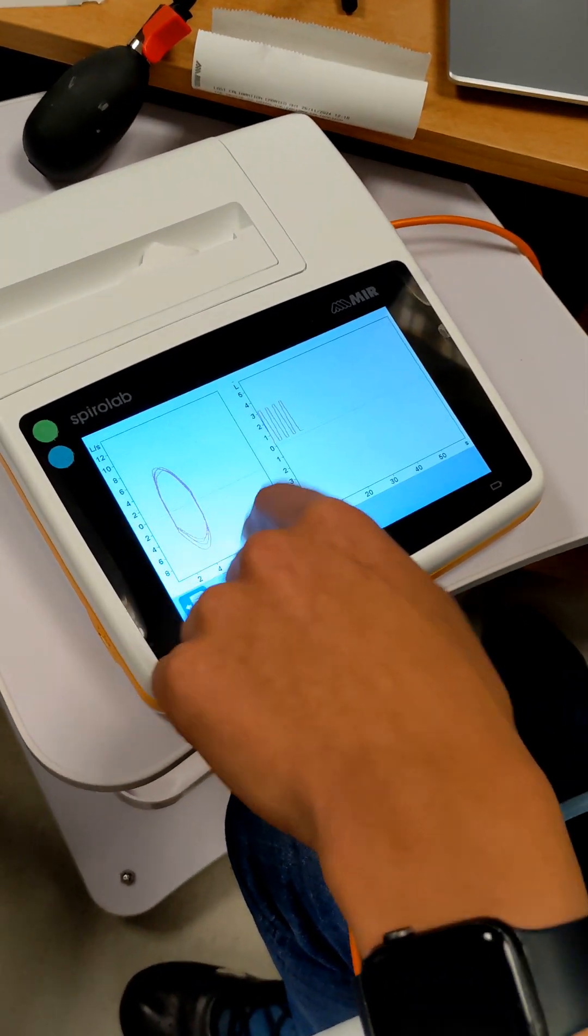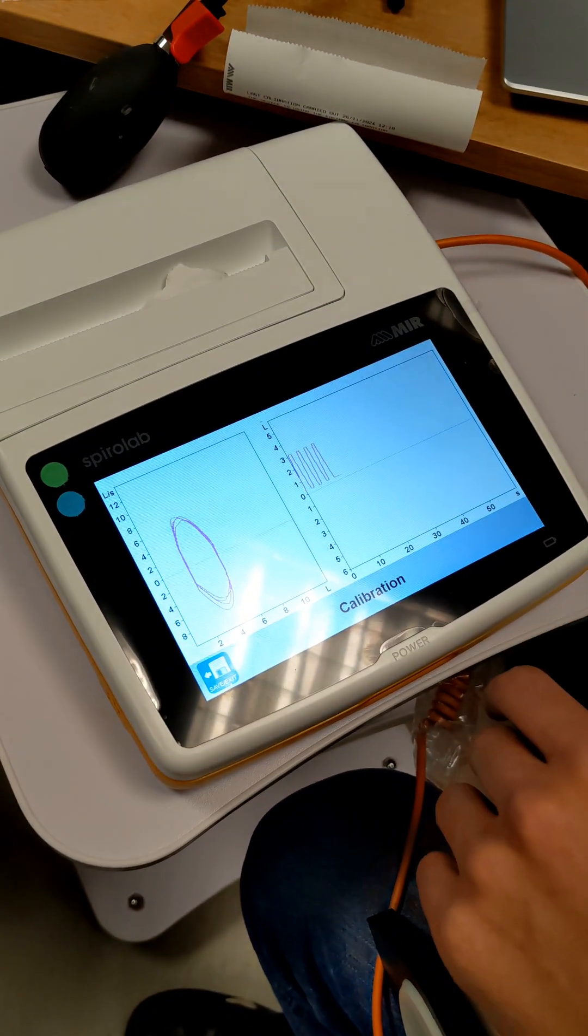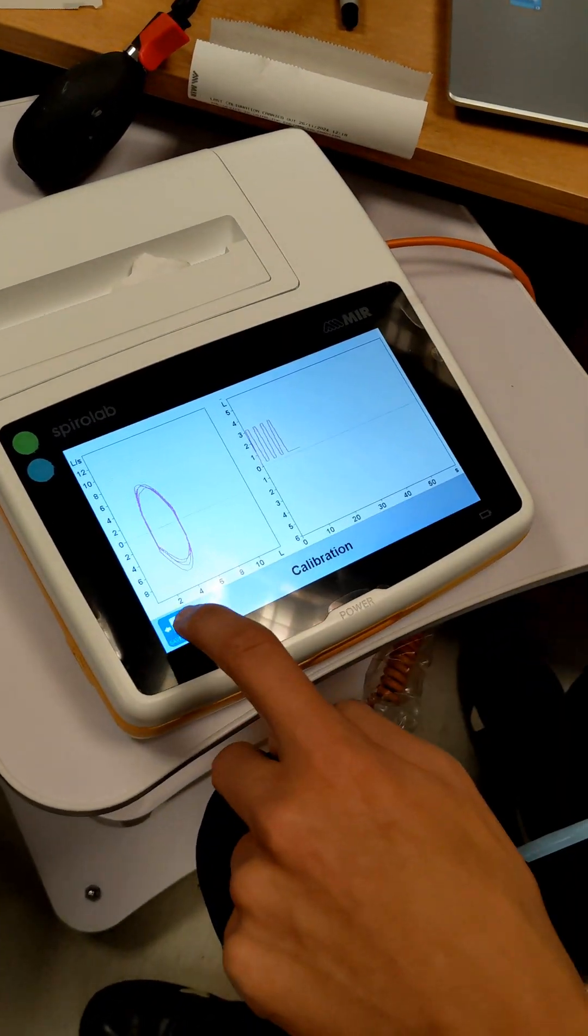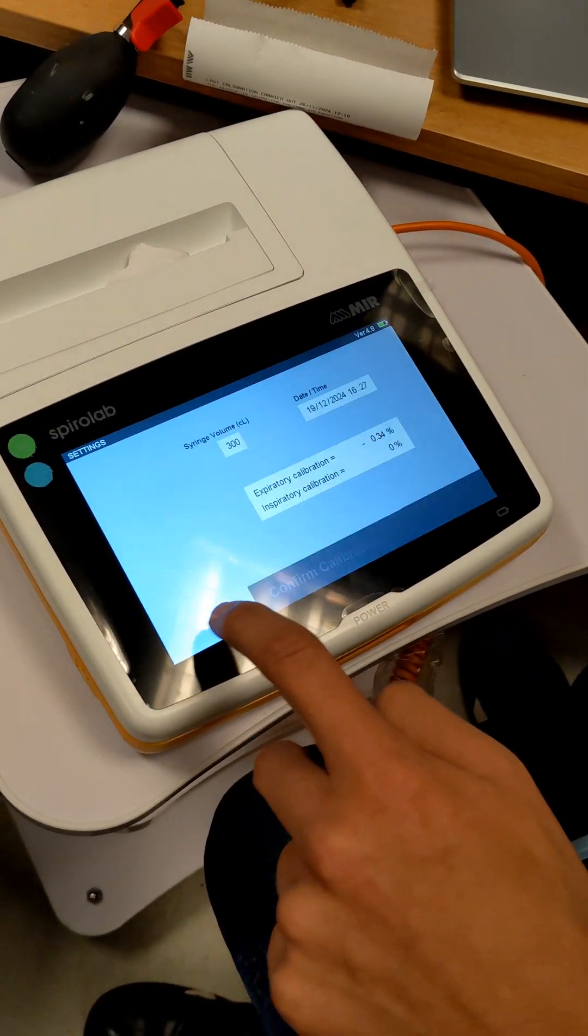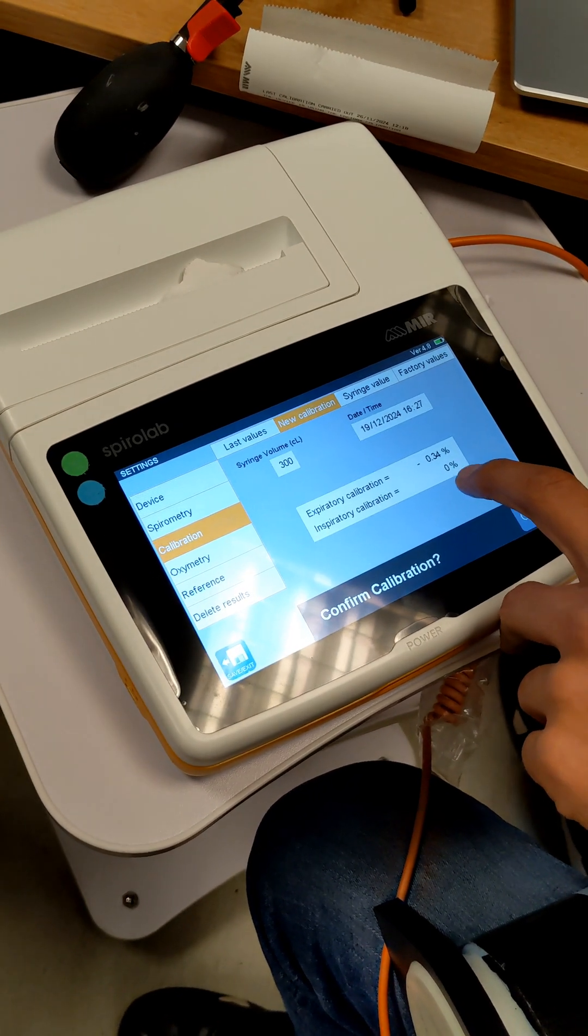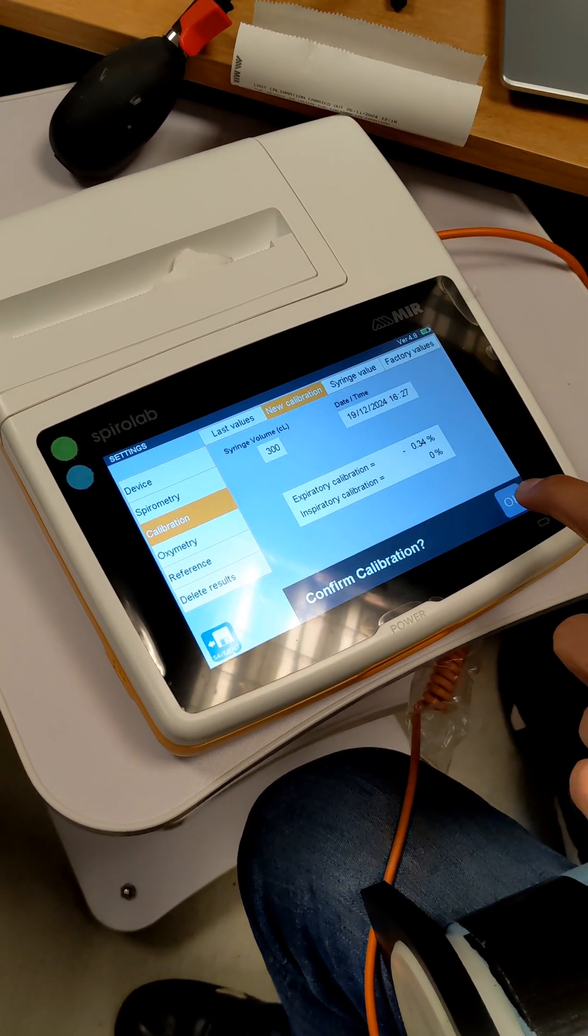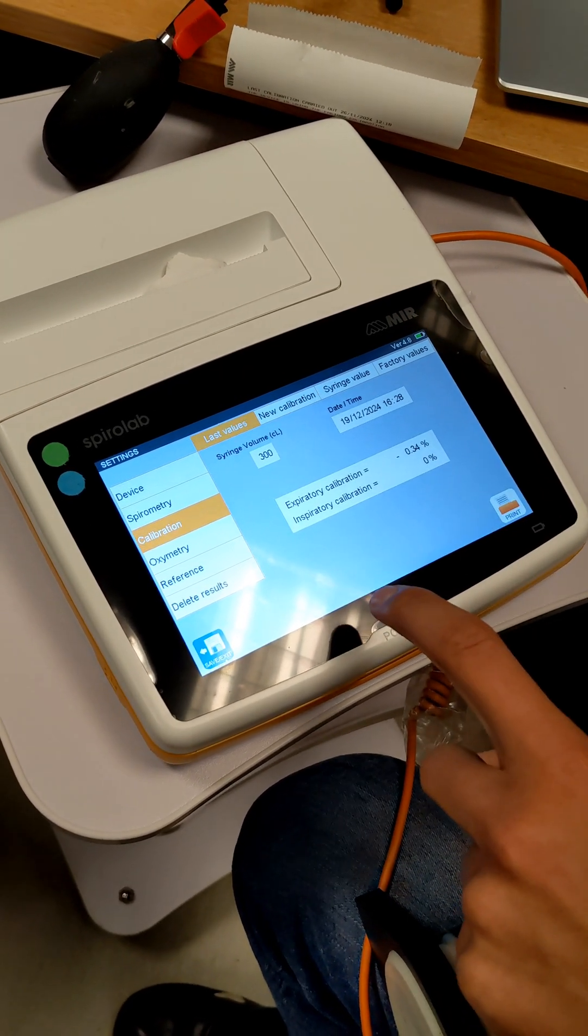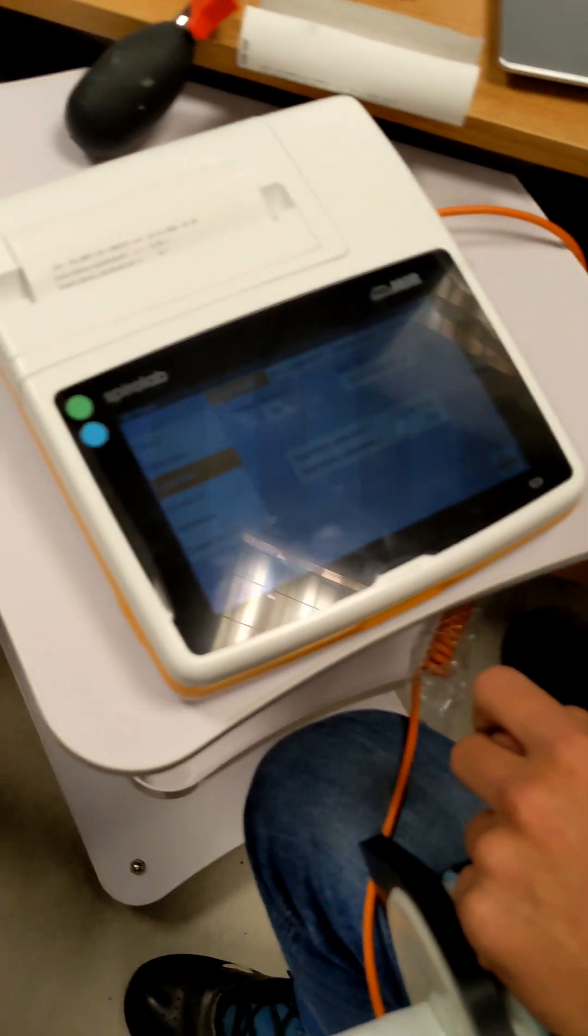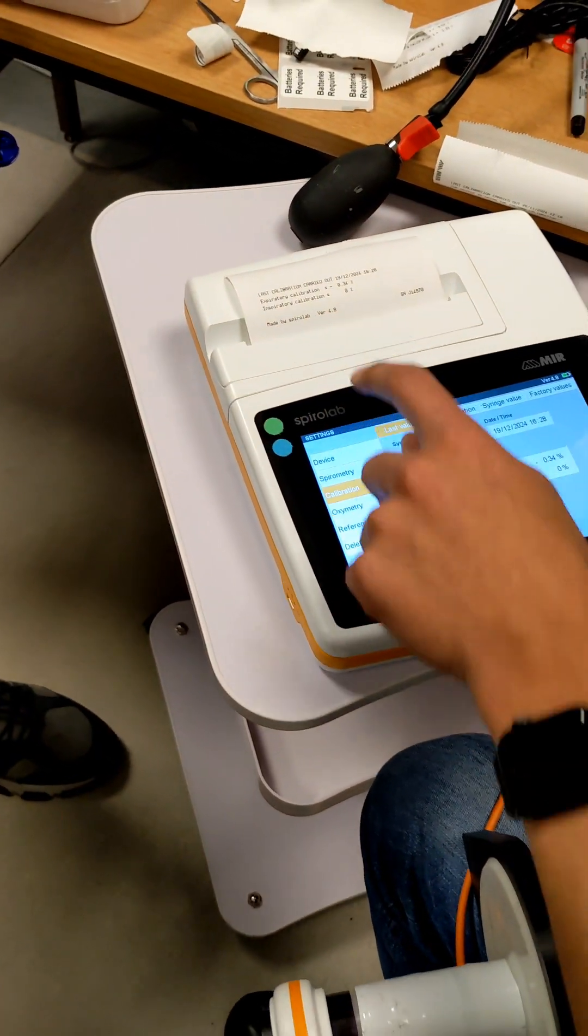As you can see, it's just doing a circle. That's fine. It shows a few lines. Press save. It gives the new calibration values. Press OK. Then print. And that's done.